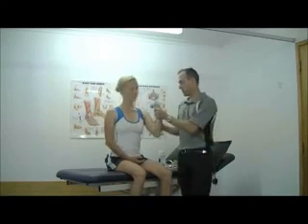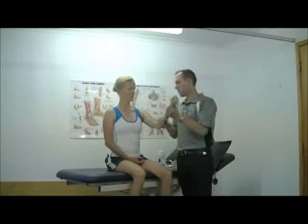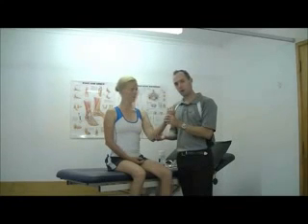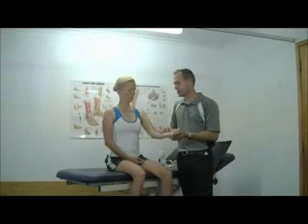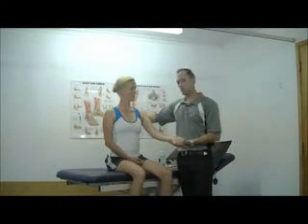So here we're quite simply using the elasticity to resist extension and then to assist flexion. Very simple. With biceps, as you'll see in one of our other videos, we can fine-tune that a little bit more to add in the supination component of your biceps muscle. But in many instances, we just need to take some load off the particular tissue for a short period of time, and that will allow things to settle down. And if we were taping this for a biceps problem, we could run a second strip up as well.